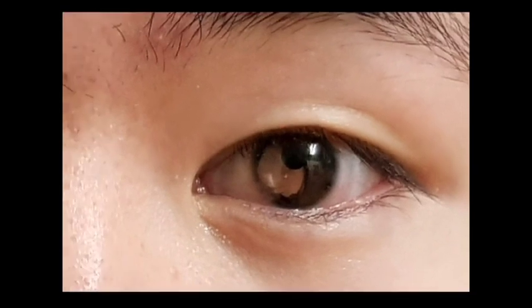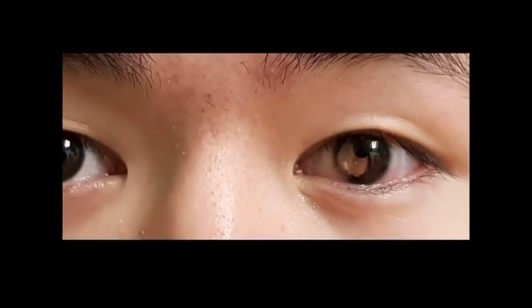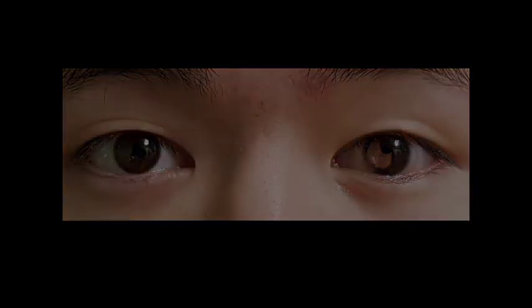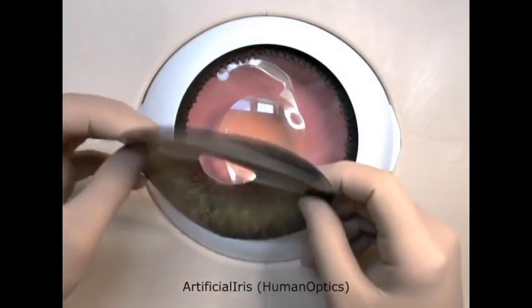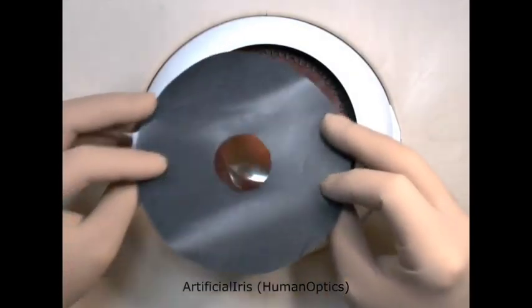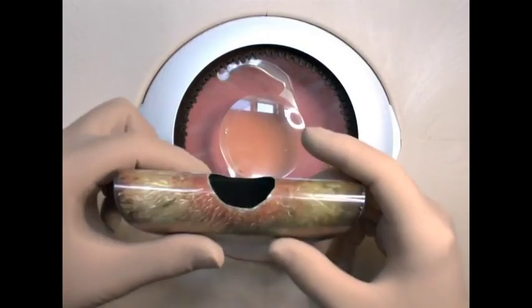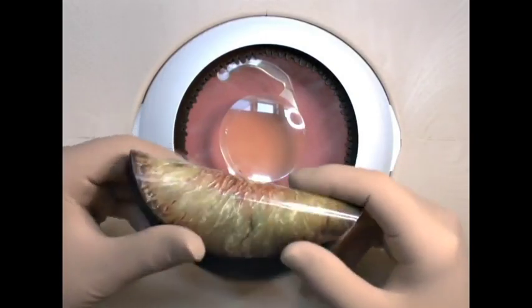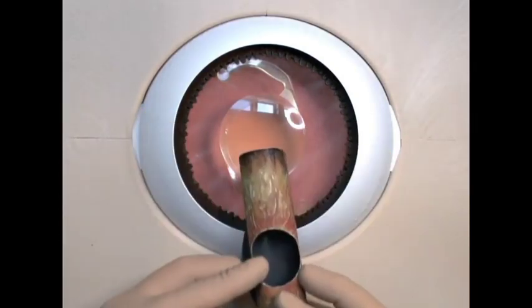Still, our patient is satisfied not only with the functional but with the cosmetic effect as well. Excellent cosmetic effect in defects with significant loss of iris tissue or in aniridia is provided by custom colored flexible iris prosthesis.